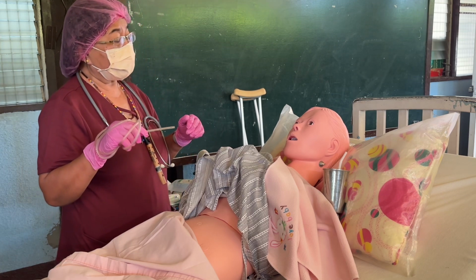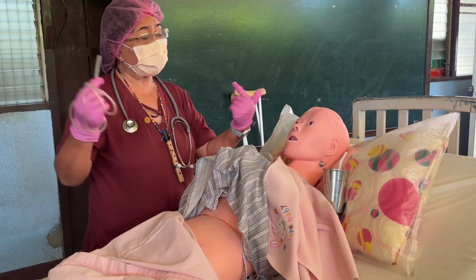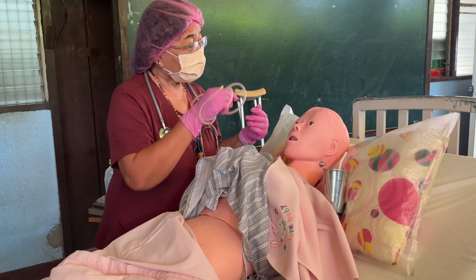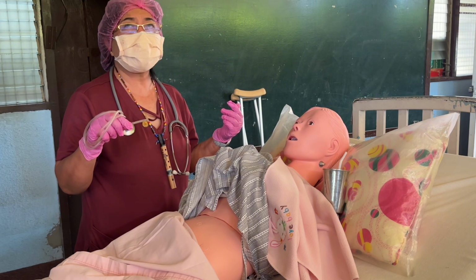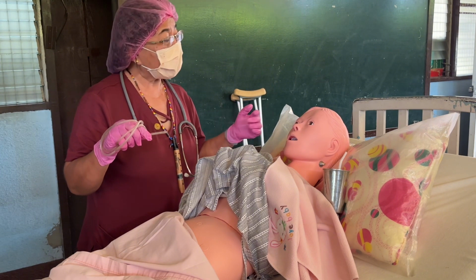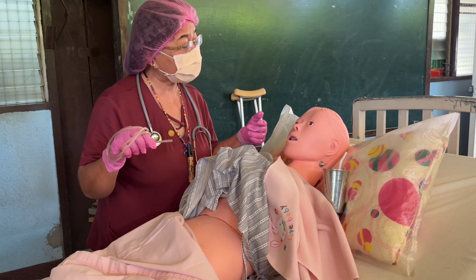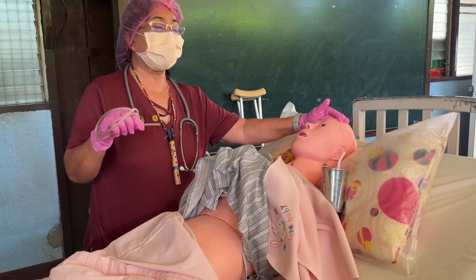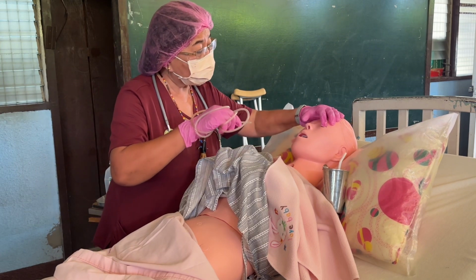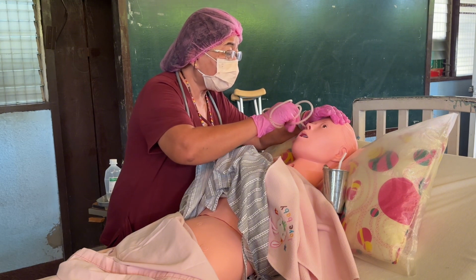Okay, ma'am? Yes? Okay. So no nasal deviation. So I choose the nostril at the right. Okay, what is the position of the head? Neutral or hyperextended? Okay? Ma'am, kindly bend your head backwards slightly only. Okay? Then, ma'am, I'm going to insert now. Okay, slowly.